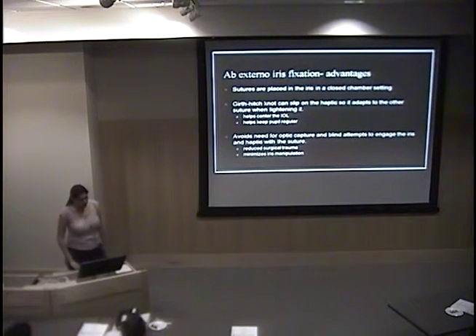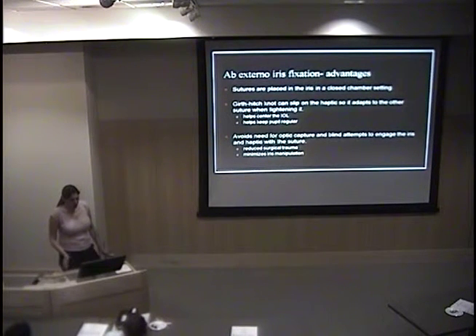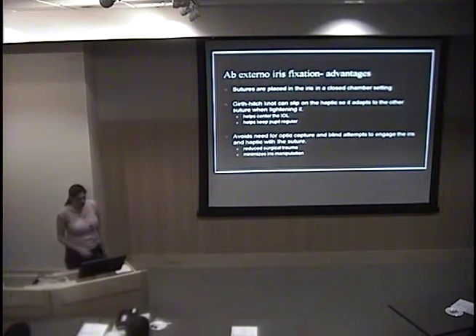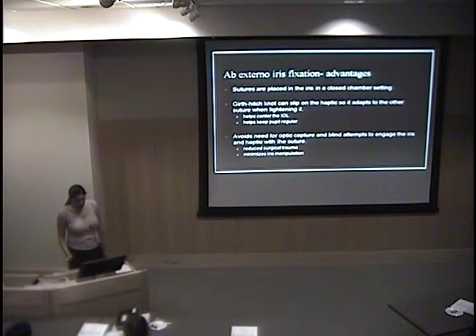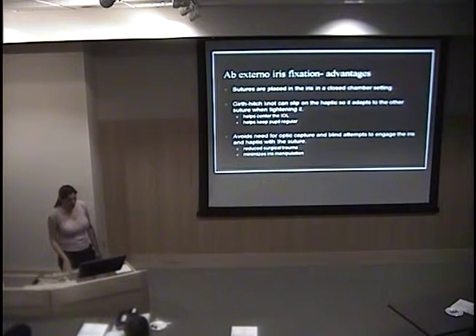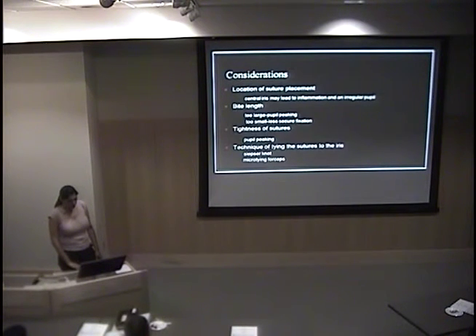So some advantages: the sutures are placed in the iris in a closed setting. That knot can slip on the haptic, so it adapts to the other suture when you're tightening it, and that will potentially help center the IOL and keep the pupil regular. You also avoid optic capture and blind attempts to engage the iris and the haptic with the suture, so you reduce surgical trauma and minimize iris manipulation.